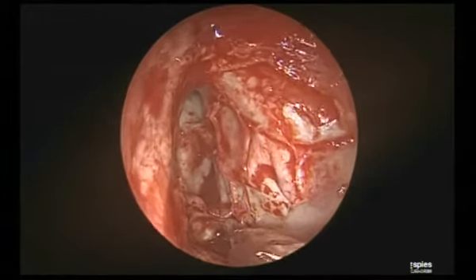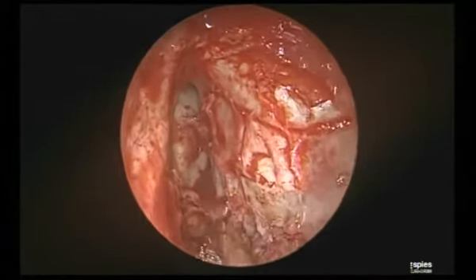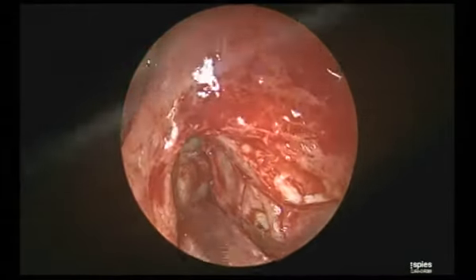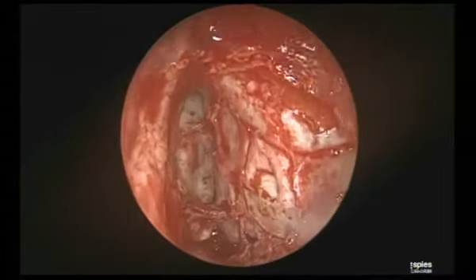It is fully covered by the mucosa. I am not pressing on the anterior ethmoid at all. Can you see? Very nice. Can you mop a bit? Yes, I am going to.